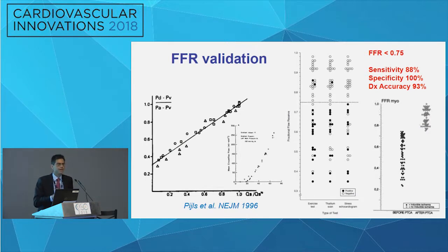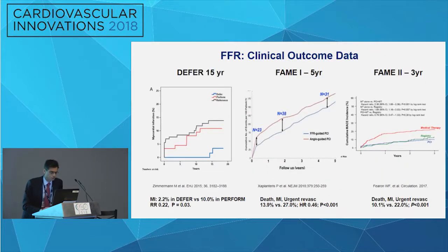And as you know, even FFR, which we consider as the gold standard, if you look at the original validation study, which now it's been 22 years, it wasn't perfect. So there were false positives and false negatives. There's not a perfect correlation between FFR and ischemia on non-invasive testing. At the same time, non-invasive testing is not perfect. You all know if you do nuclear stress testing, that's not perfect as well. So although we consider FFR the gold standard, let's not forget the validation was done compared to non-invasive imaging, and that has limitations as well.